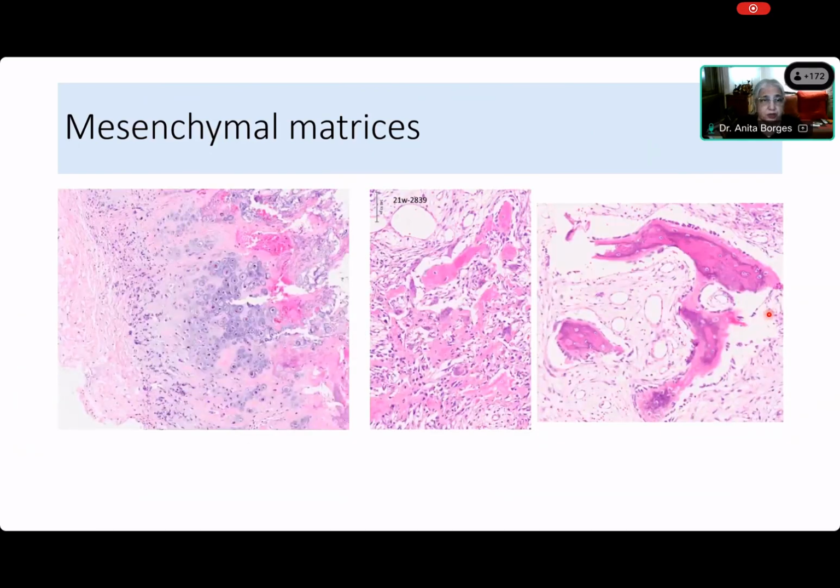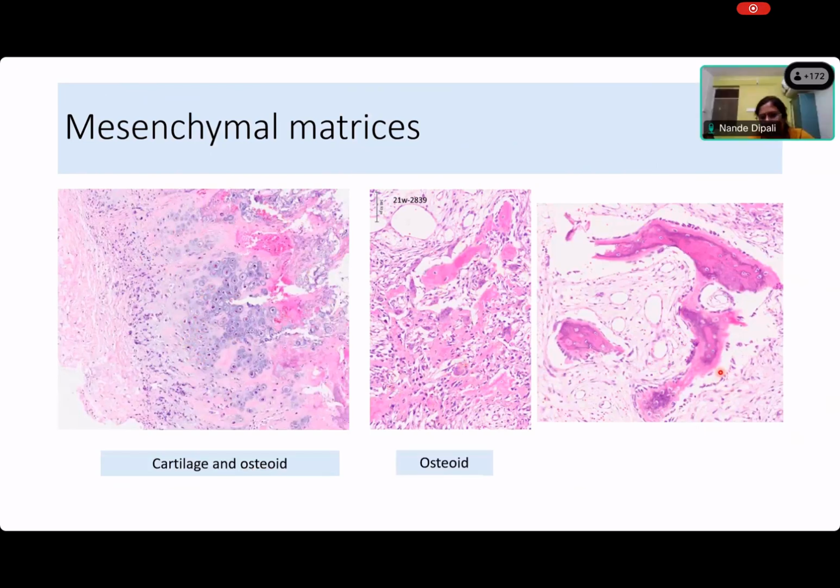Here you have other matrices. What is this matrix, Elsa, that you're seeing on the left side? Cartilage. Yes, very good. That's a matrix. Cartilage has got both the chondroid matrix as well as the cell, but that is chondroid. What is this matrix here in the middle? You got cartilage and osteoid. What is this? Osteoid. Excellent. And what is this? No, it's bone. Yes, it's woven bone. So there are different kinds of mesenchymal matrices.